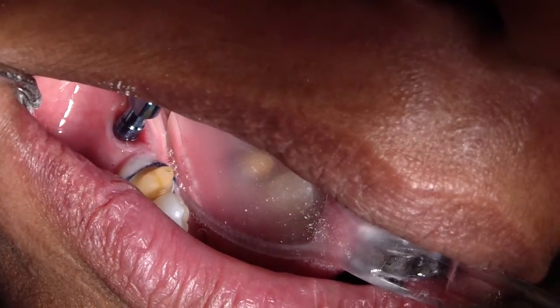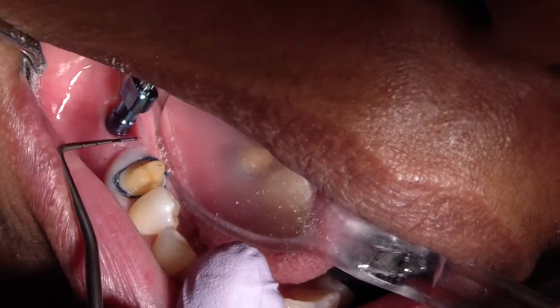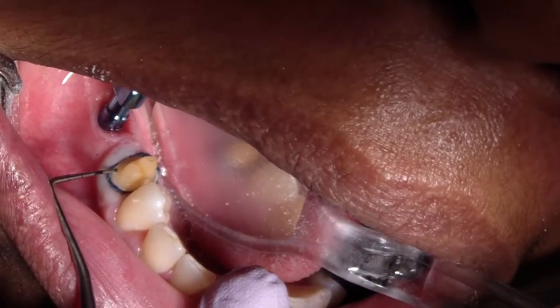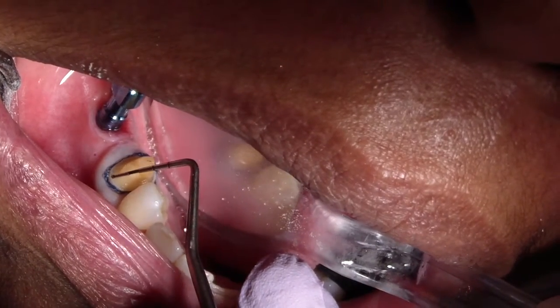Hey folks at ShellThingsSRU.com. So one of the tips — we're preparing this abutment tooth; we're going to make an FPD from the implant to the natural tooth. One of the techniques that Dr. K has taught me is when he's checking his margins, he just takes a simple perio probe and walks it around.